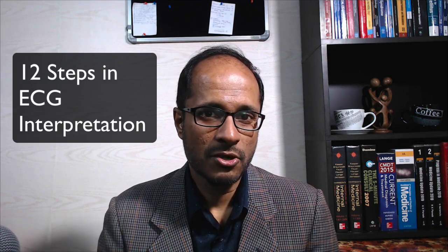What are the steps? Today we're going to be looking at the 12 steps we need to follow when reading an ECG. Especially if you're a beginner, it's important that you read the ECG in a stepwise manner so that you don't miss out on important findings. In this tutorial, I'll be showing you the 12 steps and we'll be spending some time on each of these steps. And at the end of the tutorial, we're going to put these steps into practice and we'll try it out on some trial ECGs so that you get some confidence in reading the ECGs.